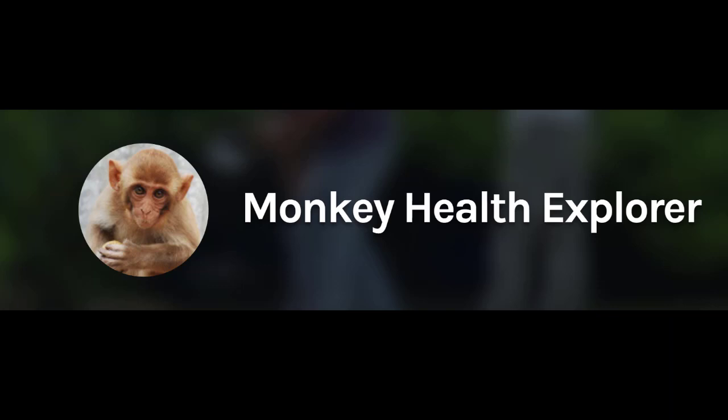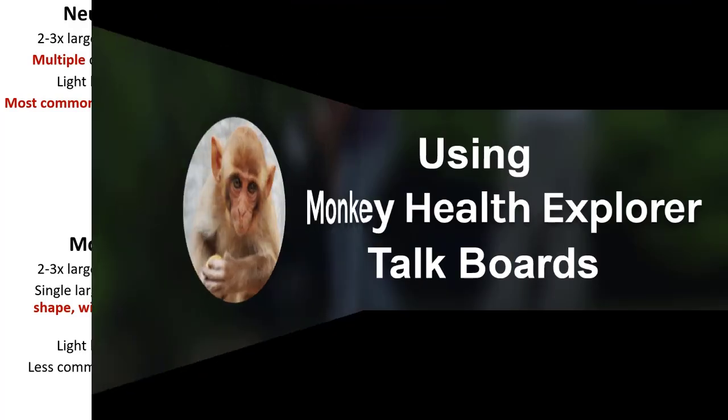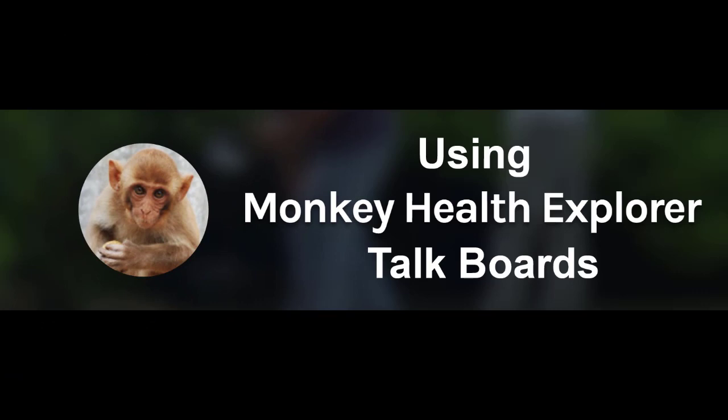In this tutorial, we'll demonstrate what we believe is the best workflow that you should use when completing the Monkey Health Explorer task. There are 2 additional tutorials that we suggest you watch. One will help you learn how to identify each of the 5 cell types that you might see during a task. If you want to learn how to discuss a specific slide with the site's researchers and other volunteers, please watch the tutorial on using the Monkey Health Explorer talkboards.